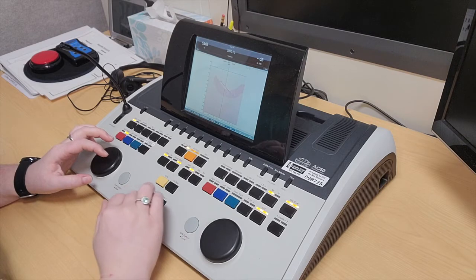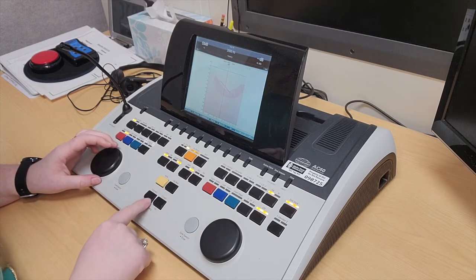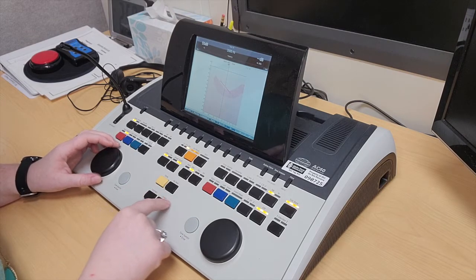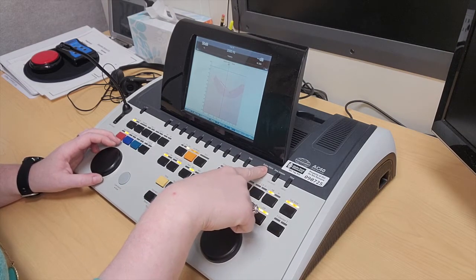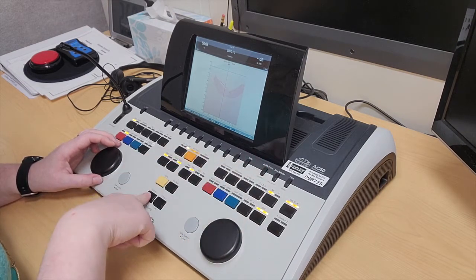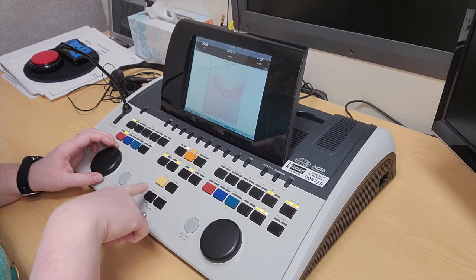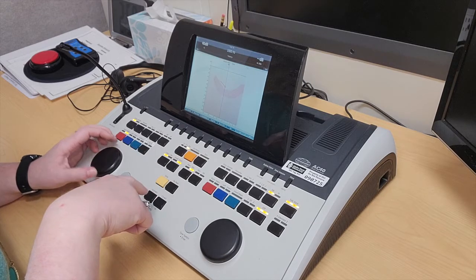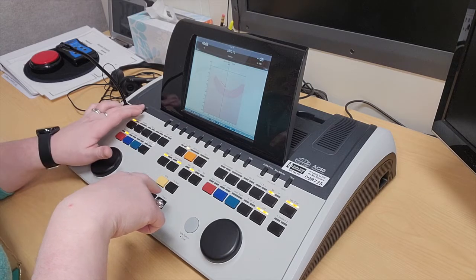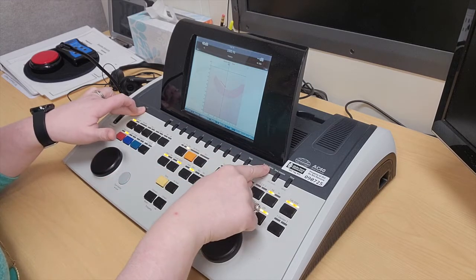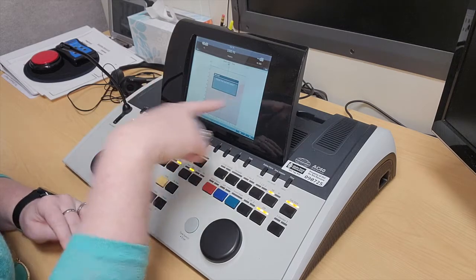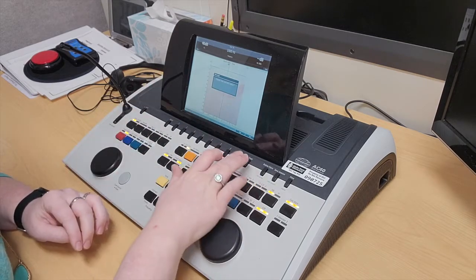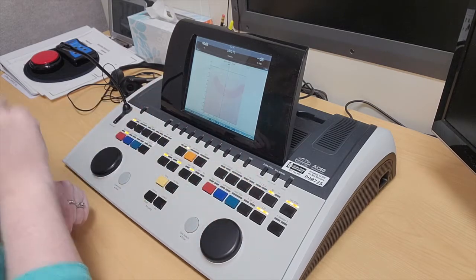In terms of deleting points, you would just go here and select delete point. If you wanted to delete the whole curve, you would press shift, delete, and then delete the current curve.